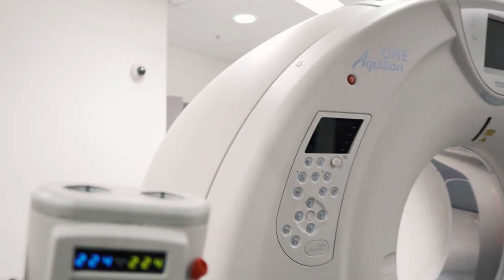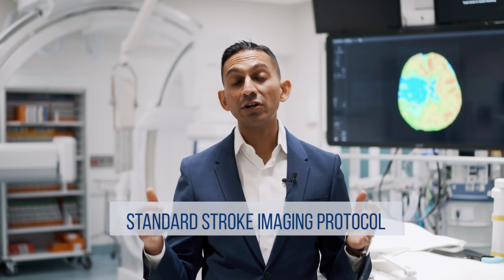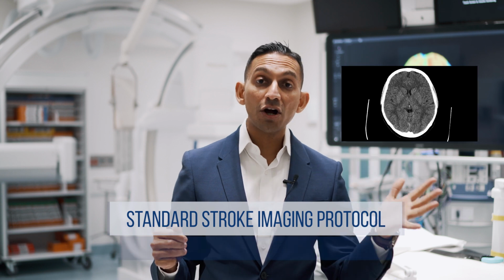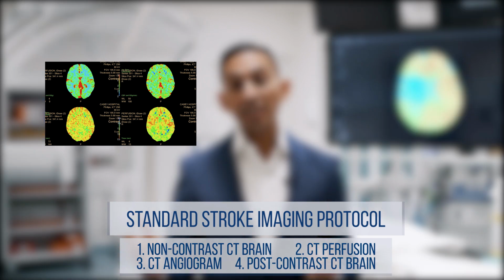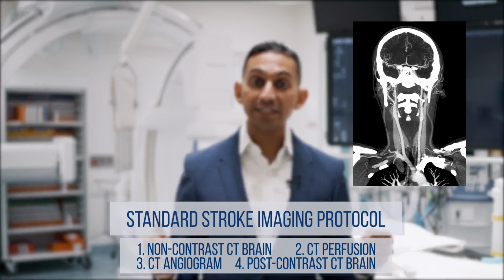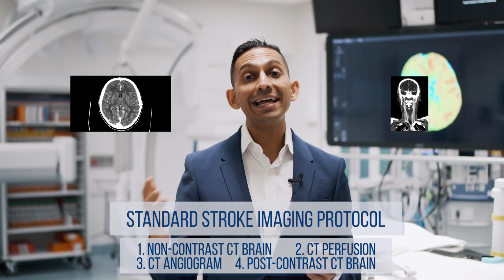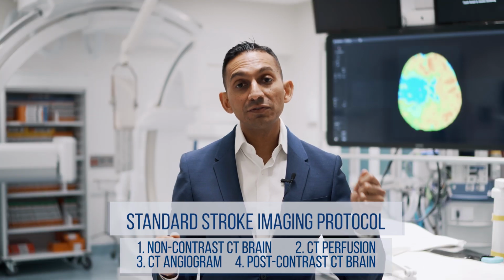They're taken to the CT scanner, which is being prepared by the CT radiographers. Our standard code stroke imaging protocol includes a non-contrast CT brain, CT perfusion, CT angiogram from aortic arch to vertex, and post-contrast CT brain. Each of these scans is important. Each one of them help with diagnosis and management. So now let's move to the reporting room where we can talk about the purpose of each of these scans.